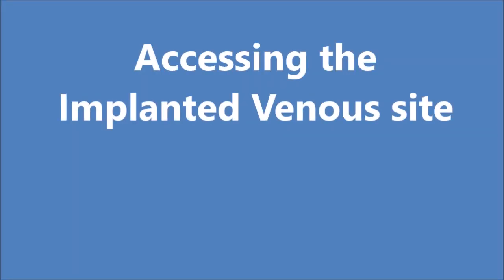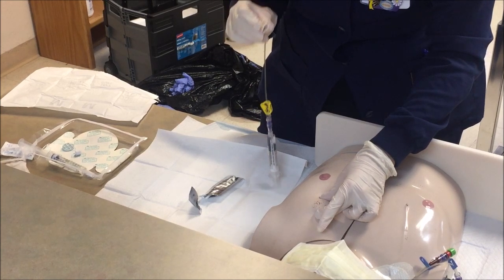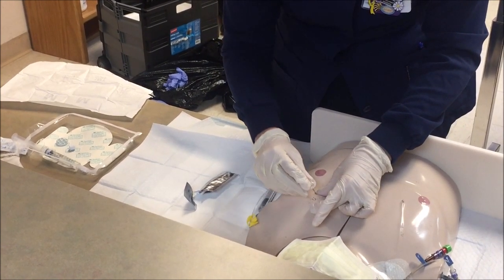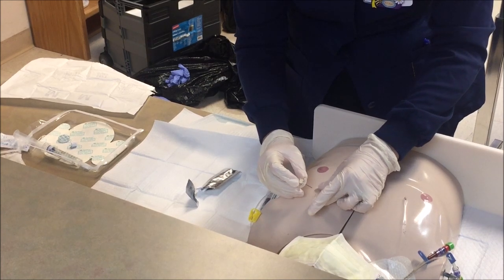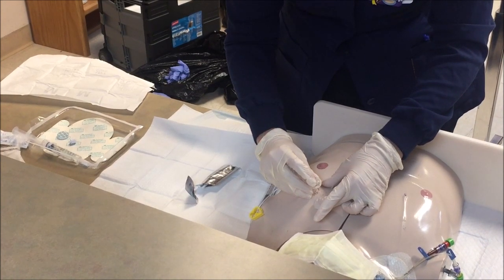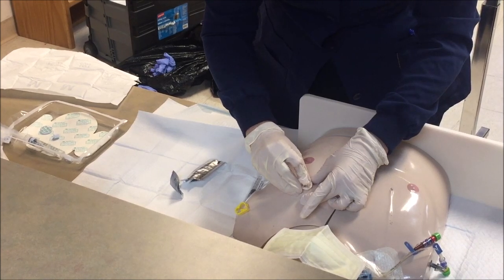Now you are ready to access the implanted venous device. To insert the needle, use the non-dominant hand to stabilize the borders of the venous access device, and use the dominant hand to pick up the non-coring needle with the syringe attached. Aim the needle for the center point of the device between the fingers. Firmly grasp the protective cap or wings of the non-coring needle and insert it firmly into the center of the port septum using a 90-degree angle perpendicular to the skin surface.